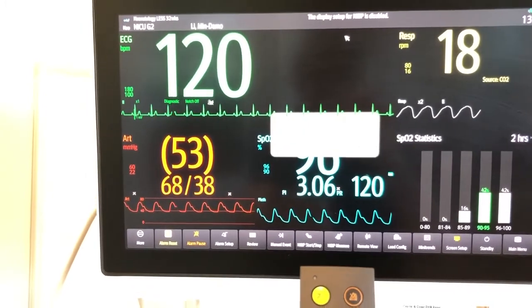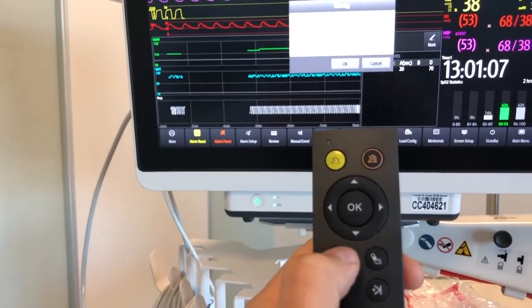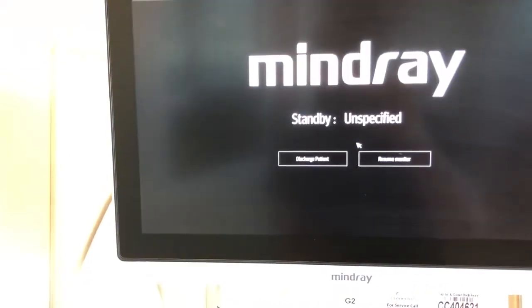Let's put it into standby mode now. Push the standby button and then use the mouse to confirm that. And we're back in standby. That's a brief video on how to use the remote control interfacing with the Mindray monitoring — hopefully that gives you an idea of what it looks like in the clinical area. Regarding range, the remote worked at up to 30 or 40 meters within the unit, going through glass and wood — no problem at all. It's an RF frequency, so pickup at a distance is just fine. If you're interested in any of this gear, just talk to your local Connected Healthcare representative and we'll set you up. Thanks, bye.